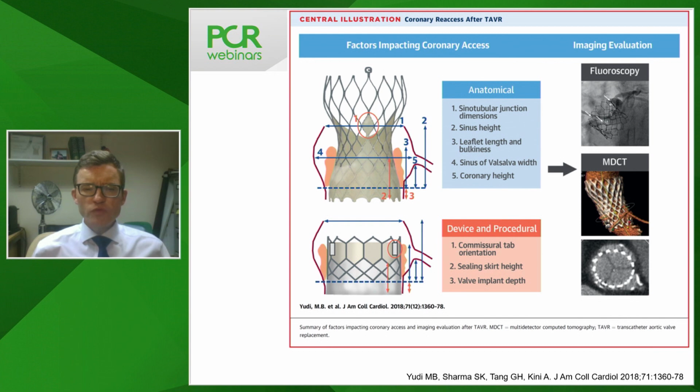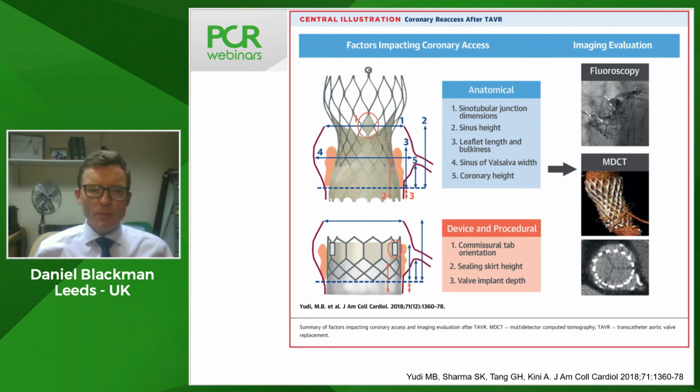I don't think there's a hard and fast rule on that, and I don't think we have any data to guide that. Our practice is predominantly to perform PCI in advance of the TAVI procedure. I think it's purely for logistical considerations. We don't want to have a problem with the PCI procedure and then be unable to go on and do the TAVI or consider it to be inappropriate. We don't want to expose the patient to contrast through the PCI procedure and then add to that with the TAVI procedure. So in most cases, we feel it's more logical to perform the PCI up front and then go on to the TAVI procedure. But again, it depends on the individual patient circumstances.